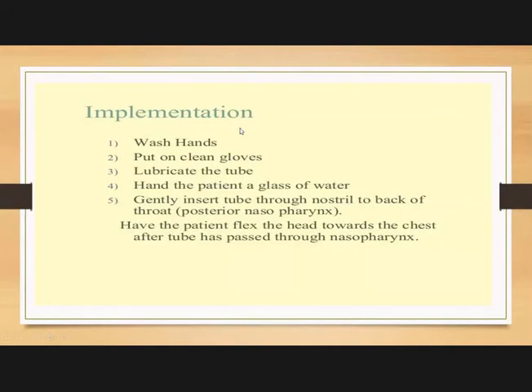Implementation: wash your hands, put on gloves, lubricate the tube with xylocaine jelly. Hand the patient a glass of water and gently insert the tube through the nostril to the back of the throat.